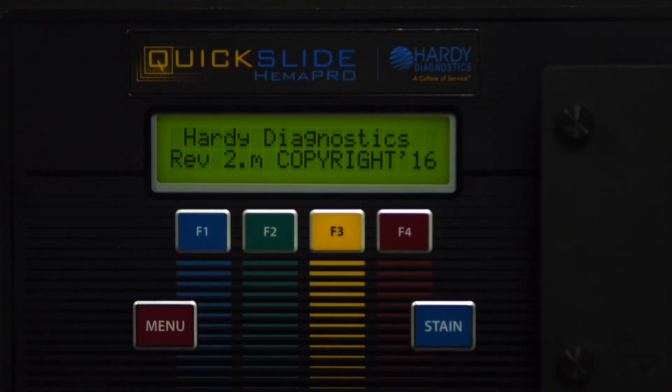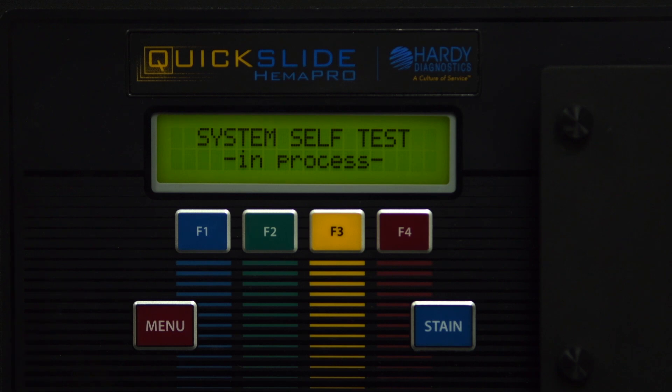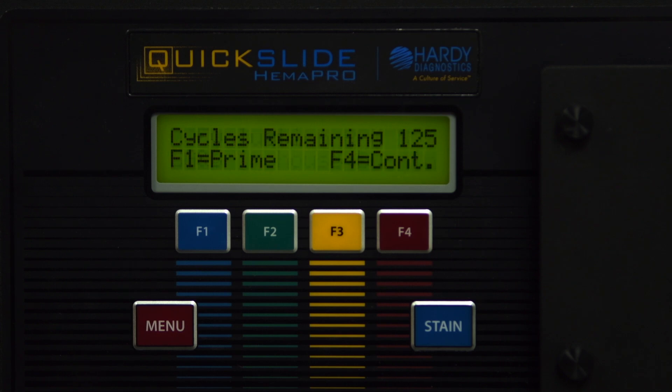After powering on the instrument, a self-test will be automatically performed. Once this test is passed successfully, the instrument will drain the cuvette, and then the display will read F1 to prime and F4 to continue.